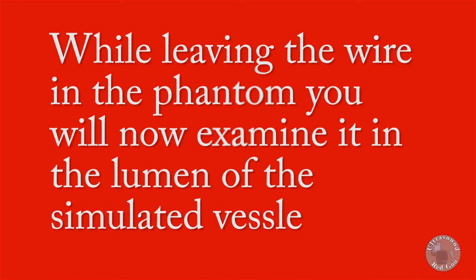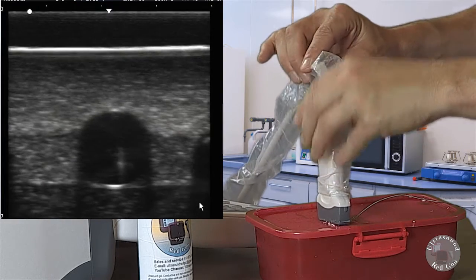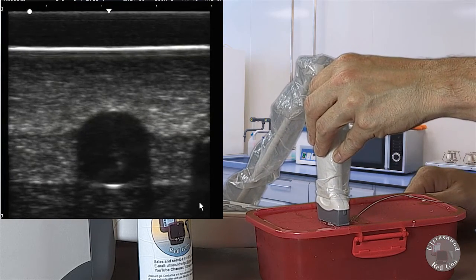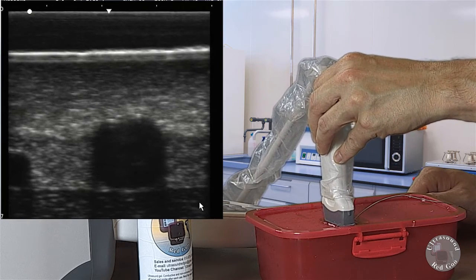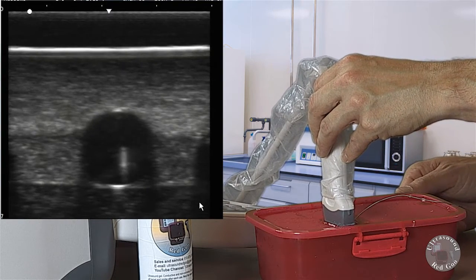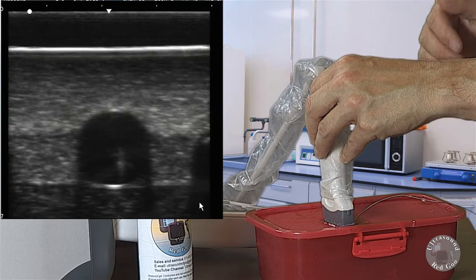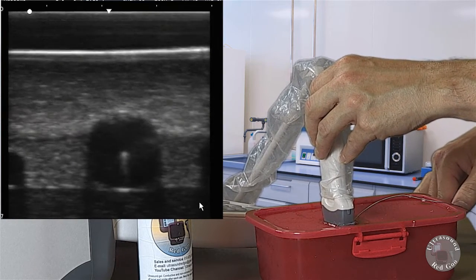Now at this point I can dilate if that's required. What I want to do though is first let's take a look at the wire in the lumen of the vessel. Okay, one thing I want to point out right now is that our access occurred out of plane - that was out of plane or in the short axis using the ultrasound probe this way. I can see the artery and the vein if I'm doing this technique on a real person. So out of plane allows us to see just the tip of the needle, but I can see two structures or vessels at the same time.